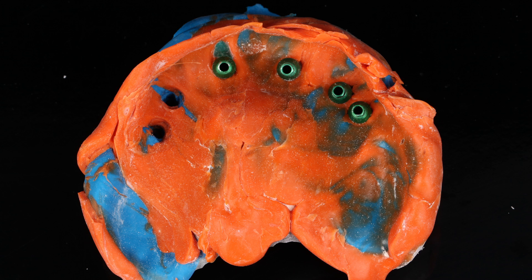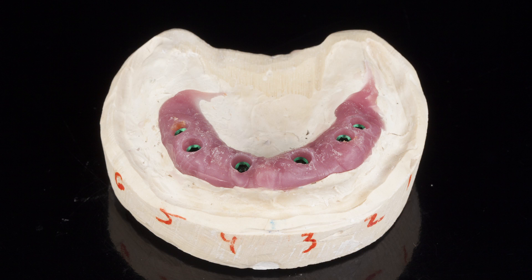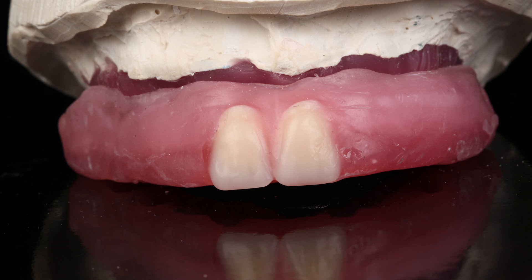Figure 9 shows a clean impression that was made using a vinyl polysiloxane material from Kettenbach. The lab fabricated a master cast and soft tissue model from the preliminary impression, as demonstrated in Figure 10. Figure 11 shows a wax rim, which was provided by the laboratory, and jaw relations were recorded using standard denture techniques.